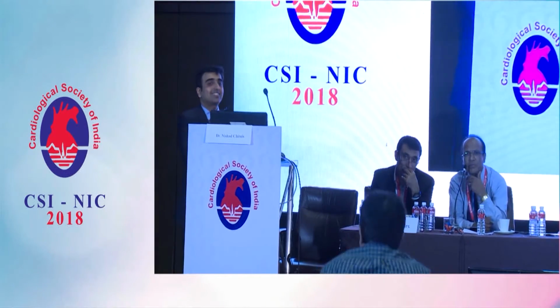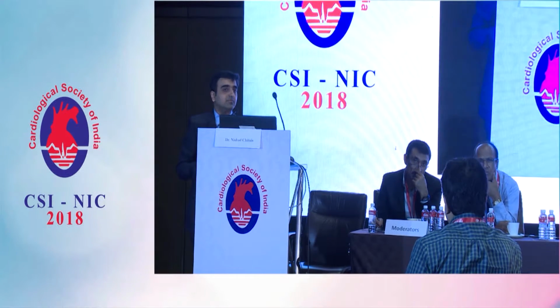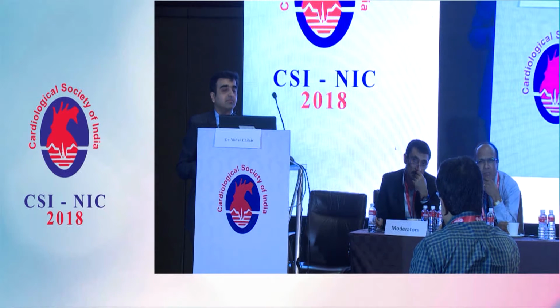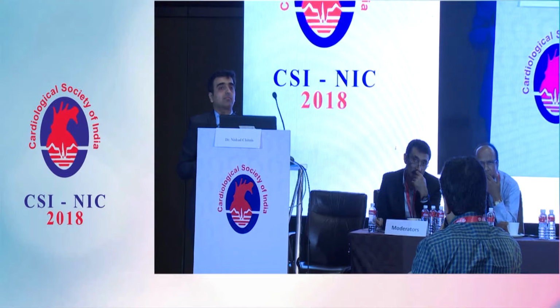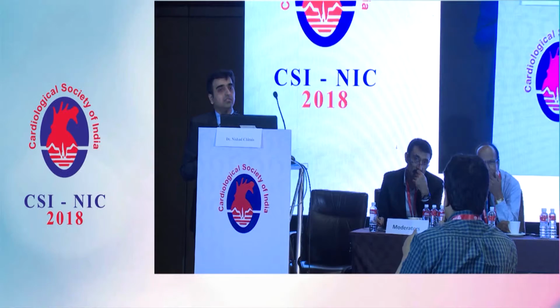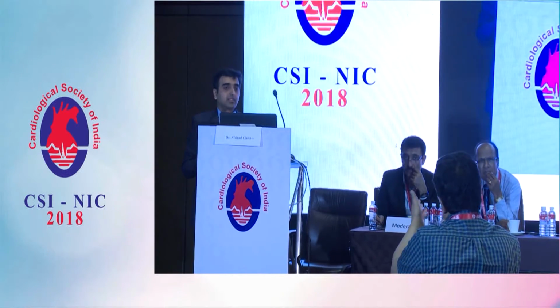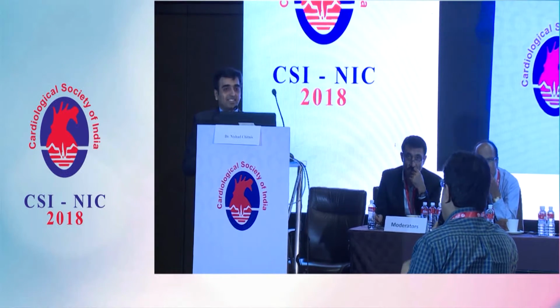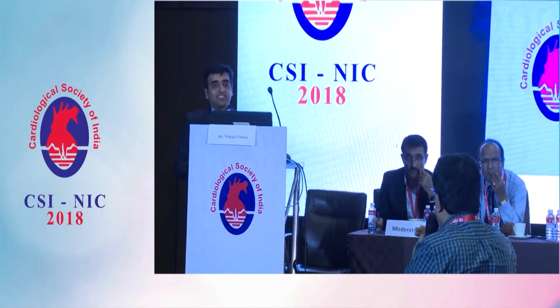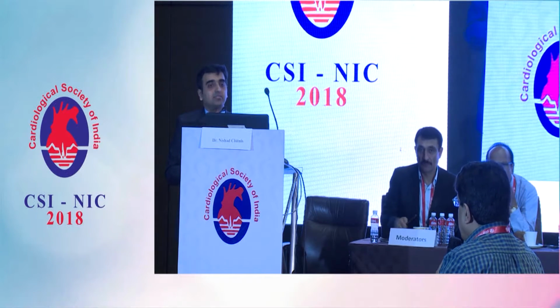No, CTO technique should be used. This is a recently deployed stent and a balloon, and it is not cemented. So you can take a microcatheter there, you can take a Tornus there very close to the non-deflated balloon, and then you can have a hard wire, with the backup support of a microcatheter or a balloon. If you want to take a simple and a soft wire, they may refuse. No, we did not try that actually. But if you have any experience of CTOs, they can be easily crossed.